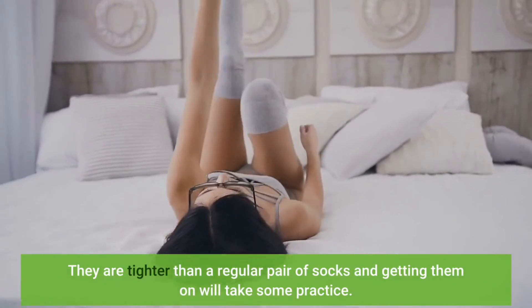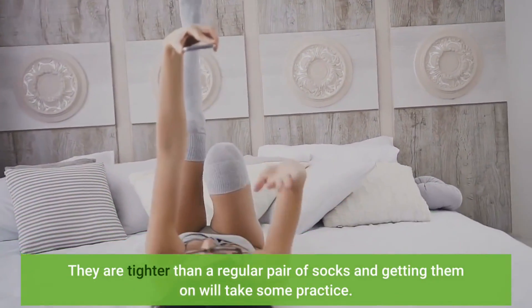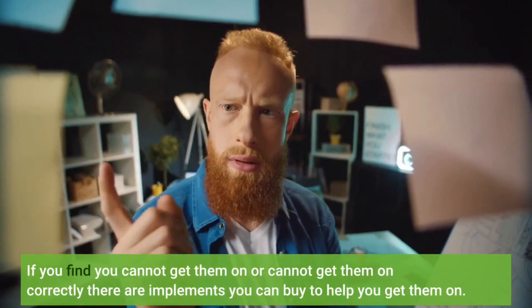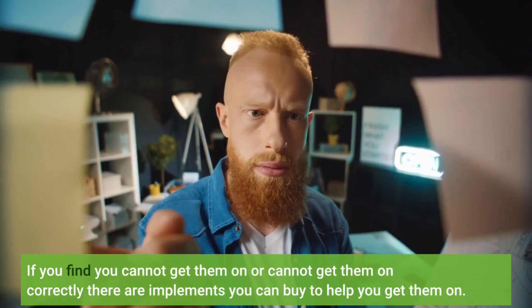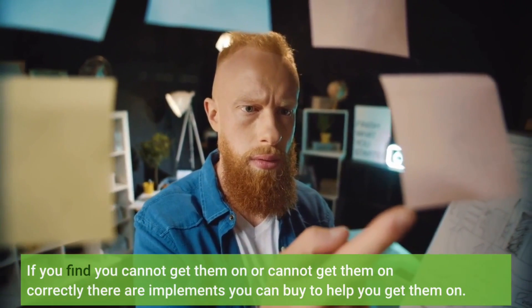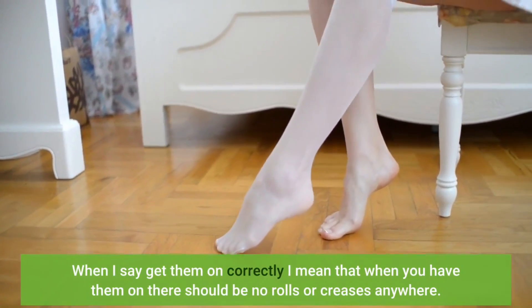They are tighter than a regular pair of socks and getting them on will take some practice. If you find you cannot get them on or cannot get them on correctly, there are implements you can buy to help. When I say get them on correctly, I mean that when you have them on there should be no rolls or creases anywhere.